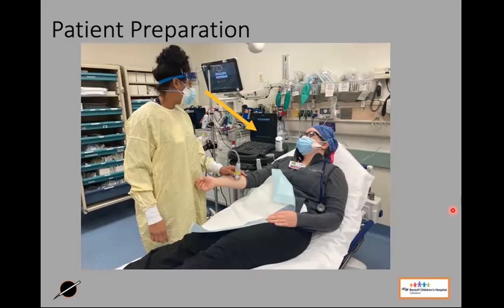So our rooms are small. If you can get access to a bigger room, I advocate for that. Makes things a whole lot easier when you're using the ultrasound machines. You definitely do not want to be looking over your shoulder at the screen and trying to move your needle in the opposite direction. It just does not help facilitate an easy introduction of that catheter.